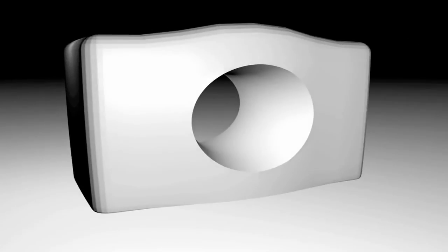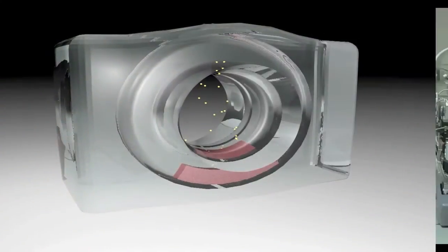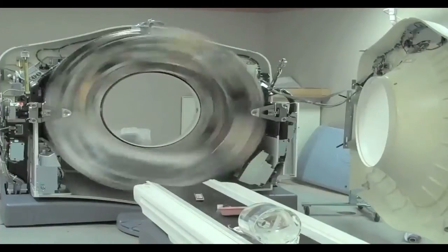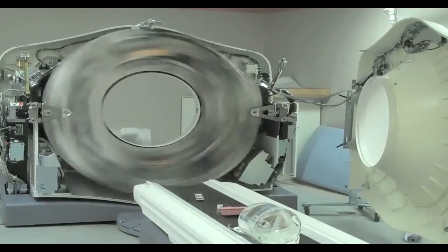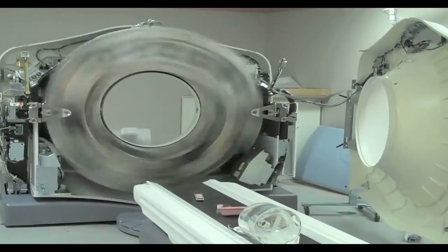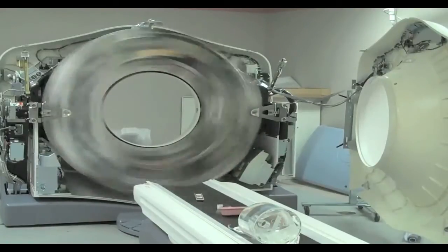A CT scanner looks like every other scanner you ever saw. It's a big white block with a hole in the middle. But inside a CT scanner is an X-ray source and some detectors, and they just rotate around the body. And if we look at one in real life, it looks something like this. So it rotates quite a lot quicker than my animation.